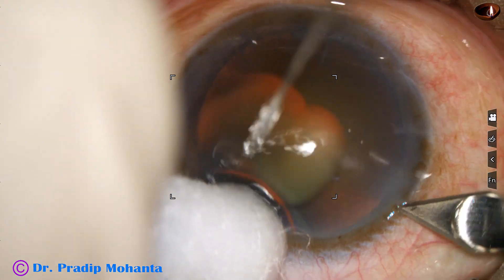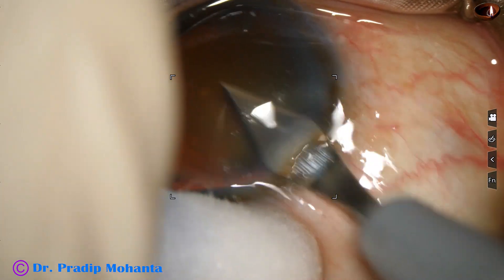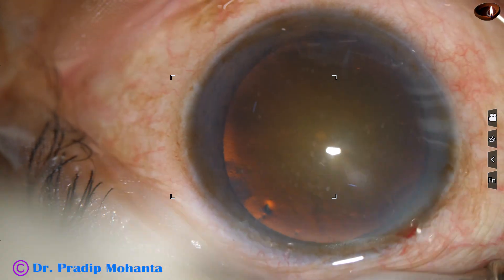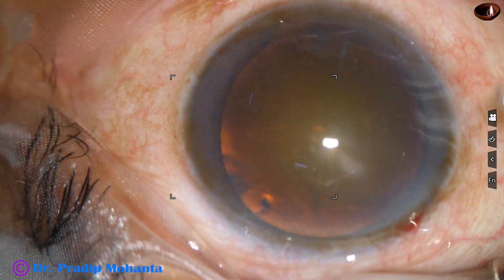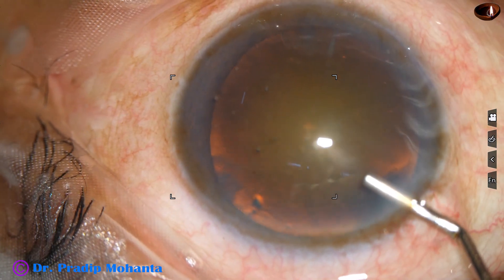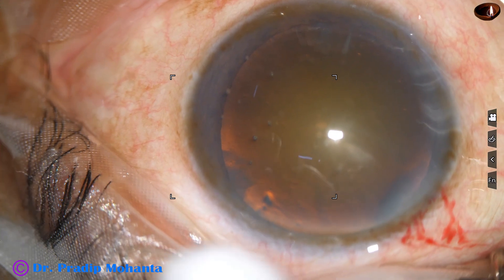This is the main incision with a 2.8 mm steel keratome. 2% hydroxypropyl methyl cellulose is injected into the anterior chamber. It is not applied over the cornea in this case.